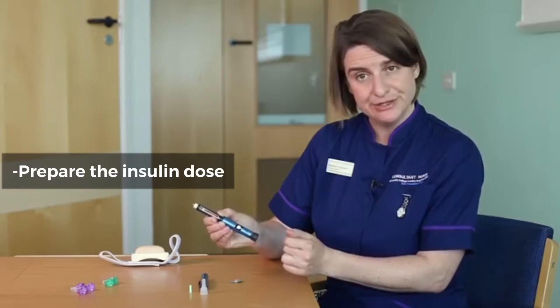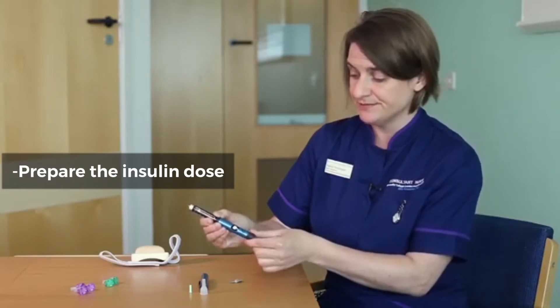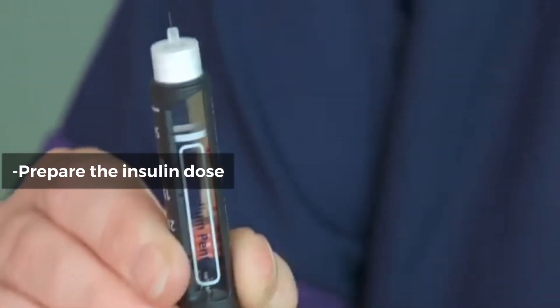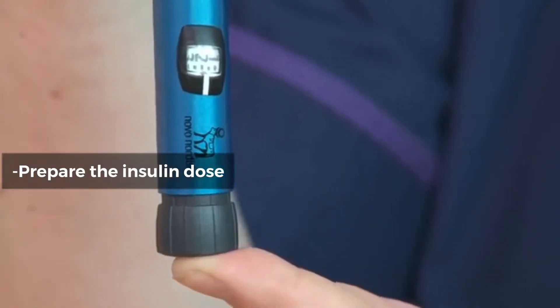So I'm going to dial up four clicks, which is two units for an air shot. I've dialed four. With the needle facing the ceiling, I'm going to push on the end of the pen.